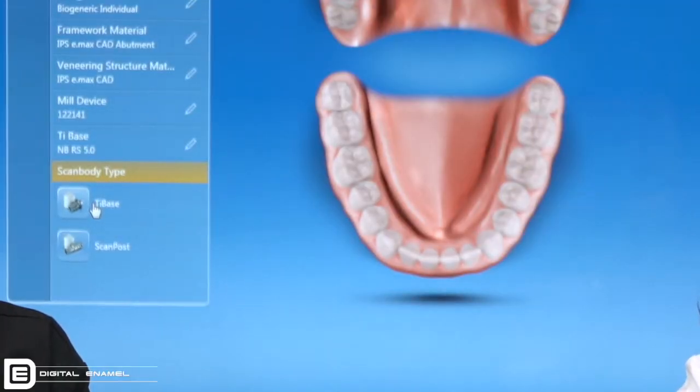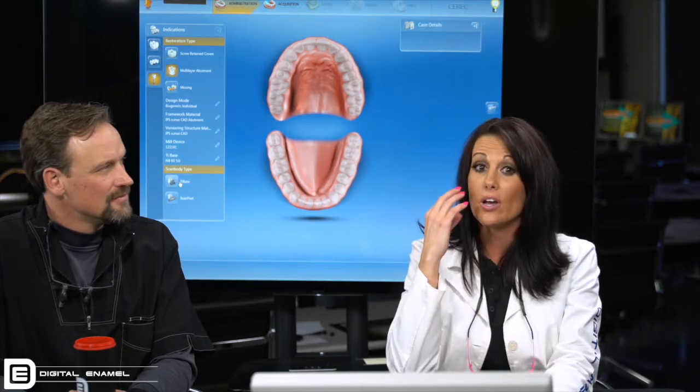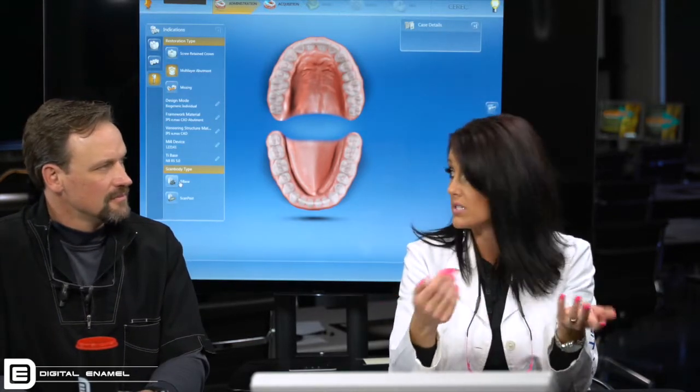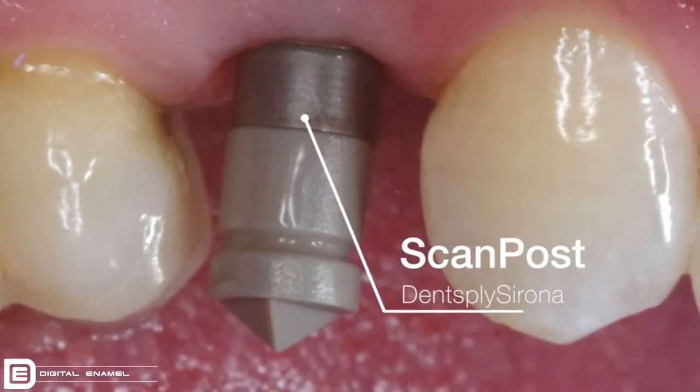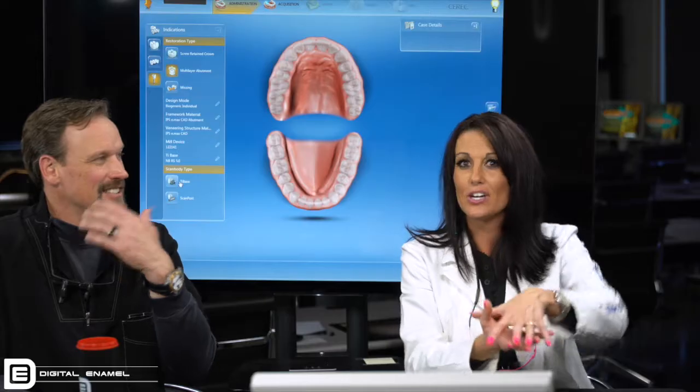You want to make sure you tell CEREC whether you're using a tie base or a scan post. The difference between the tie base and the scan post is they're exactly the same except one's tall and one's short. If you put your tie base in and your implant is placed very subgingival, it's going to disappear — it's going to be too low, and scanning it in will be difficult or almost impossible. That's where the scan post comes in because it sticks up taller. You only make that mistake once — you'll end up with a super tall or really short tooth, so you've got to set this up right.